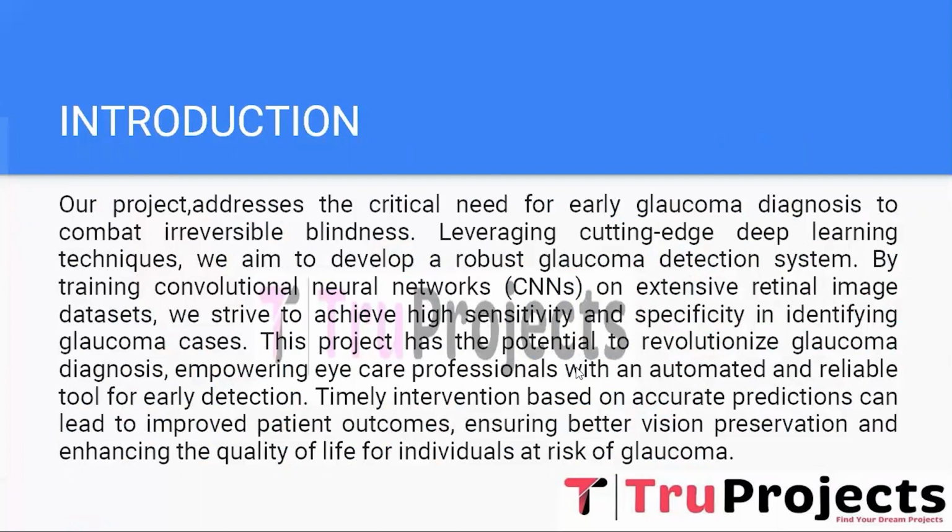The successful implementation of this project could revolutionize glaucoma diagnosis, offering eye care professionals an automated and trustworthy tool for early detection. By enabling timely intervention based on accurate prediction, we aspire to enhance patient outcomes, preserving vision and improving the overall quality of life for individuals at risk of glaucoma.